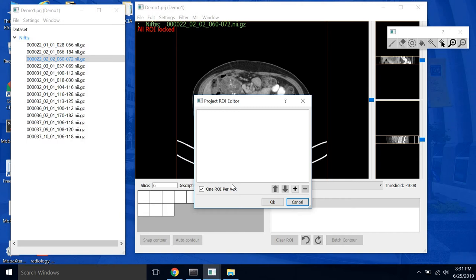You may want to have multiple ROIs per voxel. For example, if you're segmenting liver tumors you may want your tumor to be segmented both as liver and as tumor, but in this case to keep things simple we'll leave this selected.